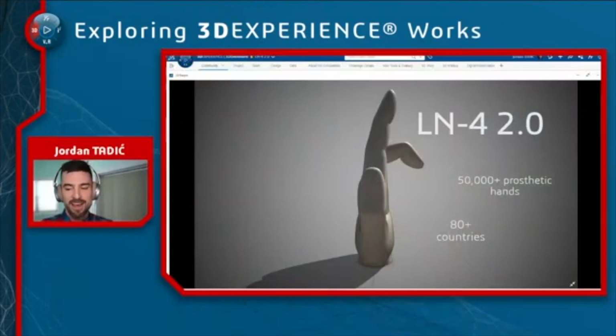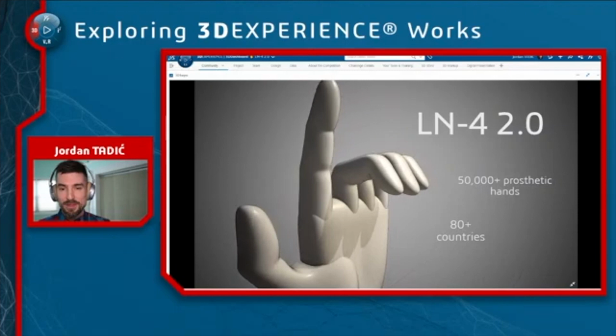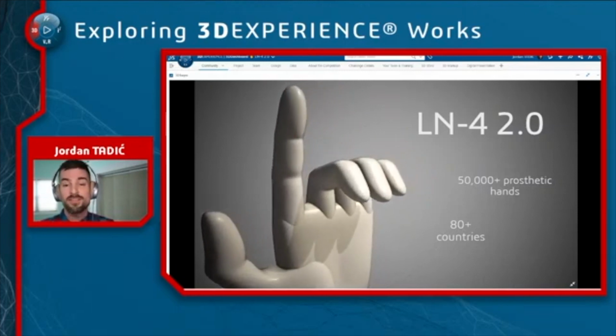So this actually comes from a real life project that I've been working on recently. It started, well, I can't say last year, that has passed already, at 3D Experience World 2020, where we had a hackathon to redesign what was called the LN4 prosthetic hand. And if you look at it on screen, this is a new version of it that we're working on. But the previous version, they've distributed over 50,000 prosthetic hands to over 80 countries for free.